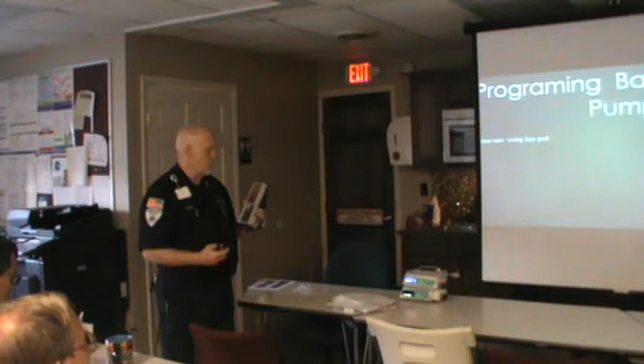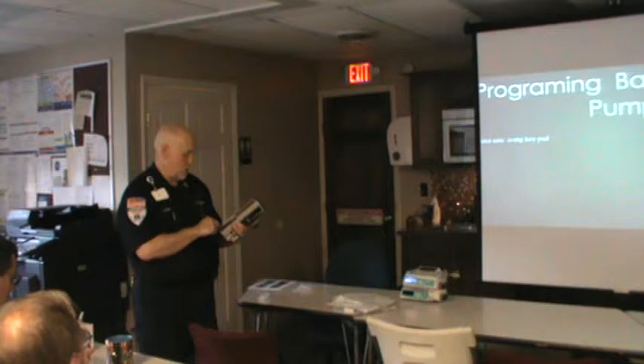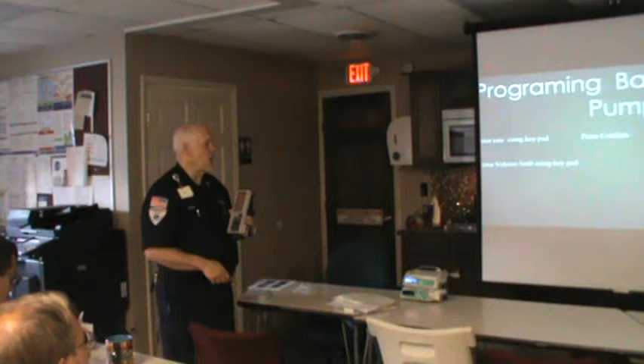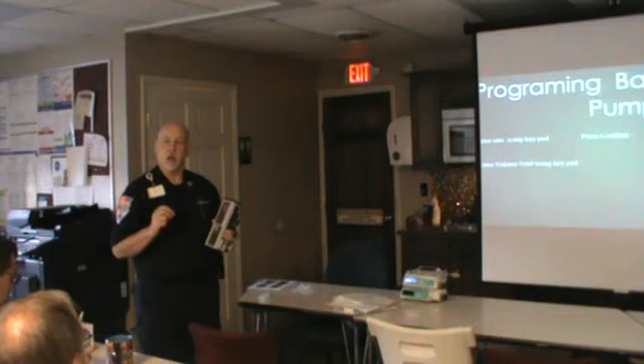Enter the rate using the keypad. Say we want it at 15cc's an hour — enter 15 and push confirm. Then it says 'enter the volume limit using the keypad.' A lot of times when I'm using these, instead of putting 60 even though I have 60 drawn up, I'll put 55 or 58, so I get a warning when we're getting close to the end and I know it's getting time to change over.